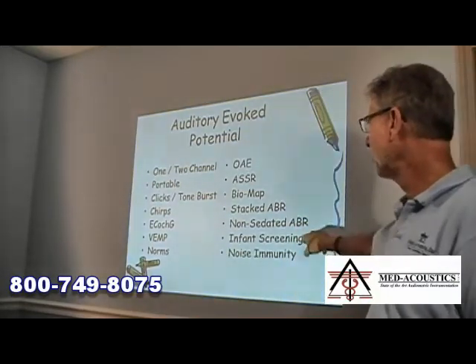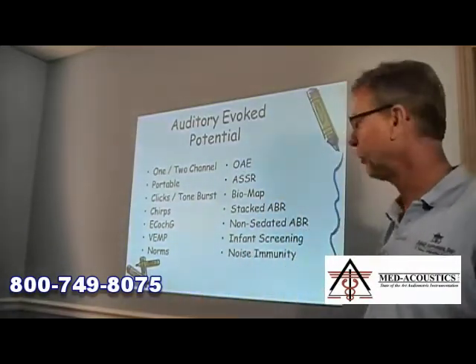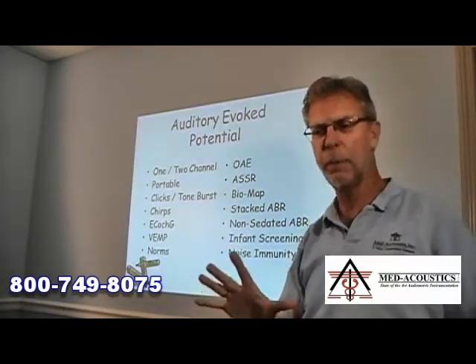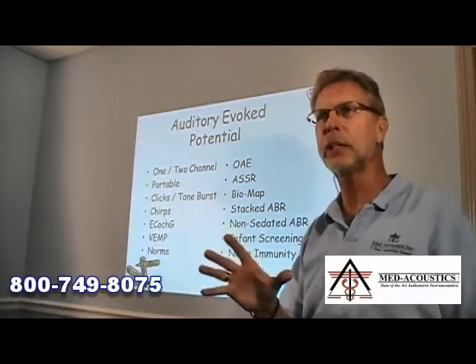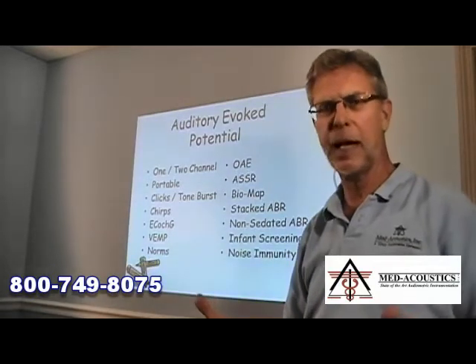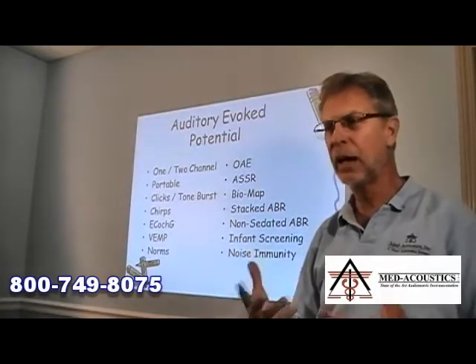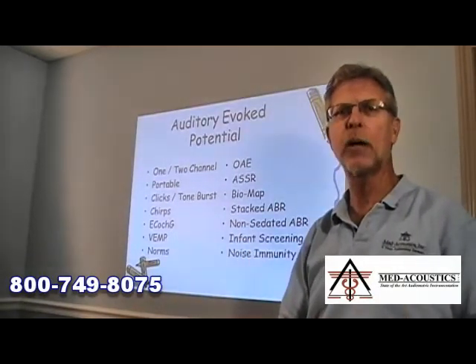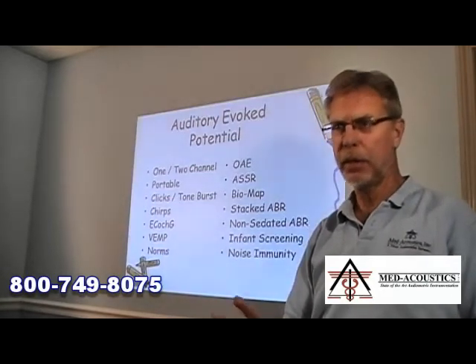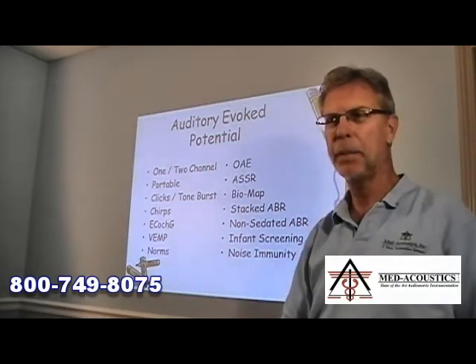Will I be doing infant screening? And then how, with this particular piece of equipment, will I be able to accommodate that? And then this very important one, last one, noise immunity. And by noise I don't mean acoustic noise, I mean electrical interference. I have had situations where the electrical interference was absolutely terrible. In fact, where the system would not run in certain environments. Absolutely would not run.